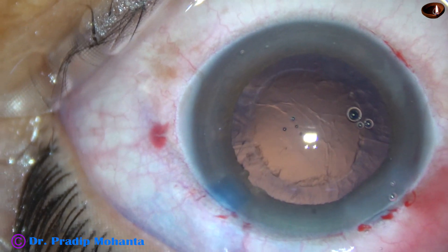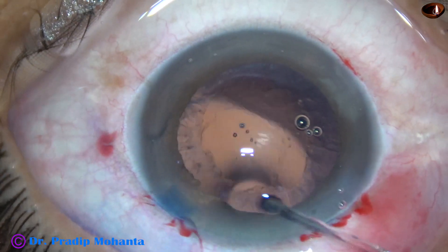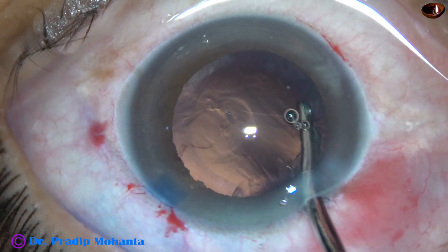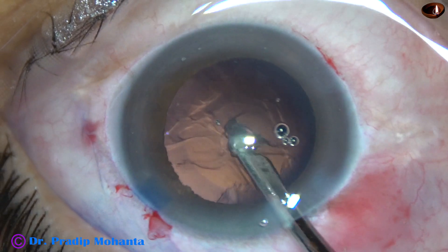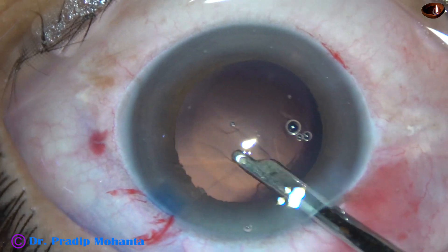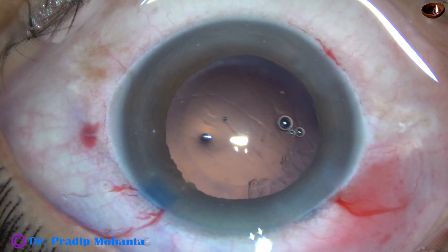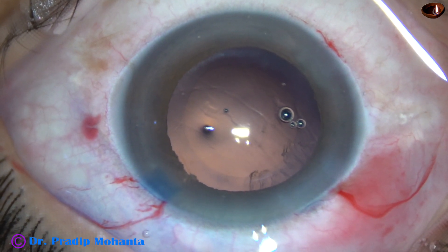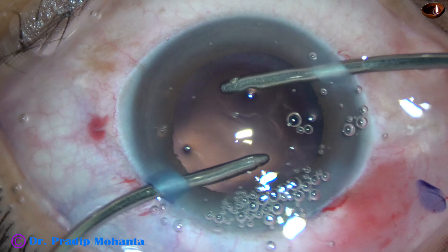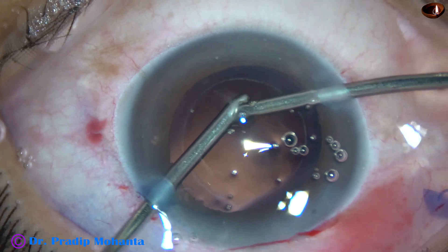Some viscoelastic is injected to protect the corneal endothelium and to maintain the depth of the anterior chamber. Cortical matter from the inferior aspect is removed with a Simcoe cannula. The assistant is ready with bimanual irrigation-aspiration cannulas, and the sub-incisional cortex is now aspirated.